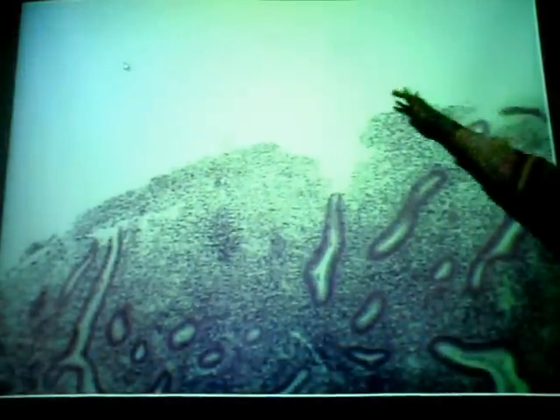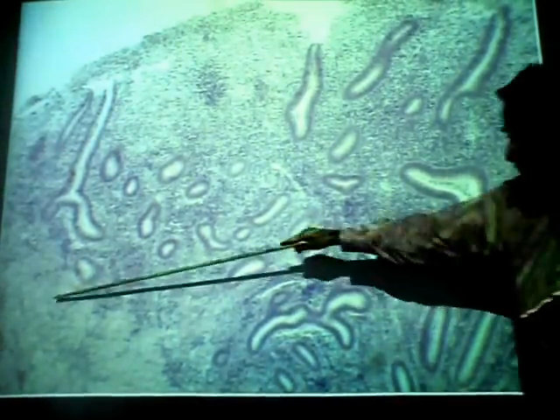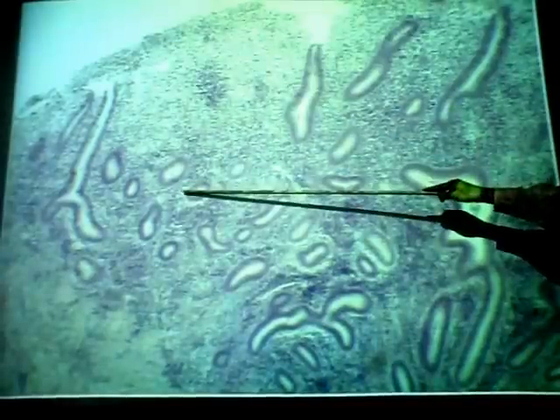What we see here, this of course is the uterine cavity. This is the endometrium, but more specifically, the stratum functionalis. You can see it's not that thick yet, because here's the myometrium. This is all the stratum functionalis. Lots of glands, lots of blood vessels. It's getting ready for implantation of the embryo should fertilization occur. Okay? And here you can see a little bit of the epithelium. Now the epithelium here, which lines the uterus, is a simple columnar, not ciliated like in the oviducts, but just simple columnar. Okay? So this is stratum functionalis.